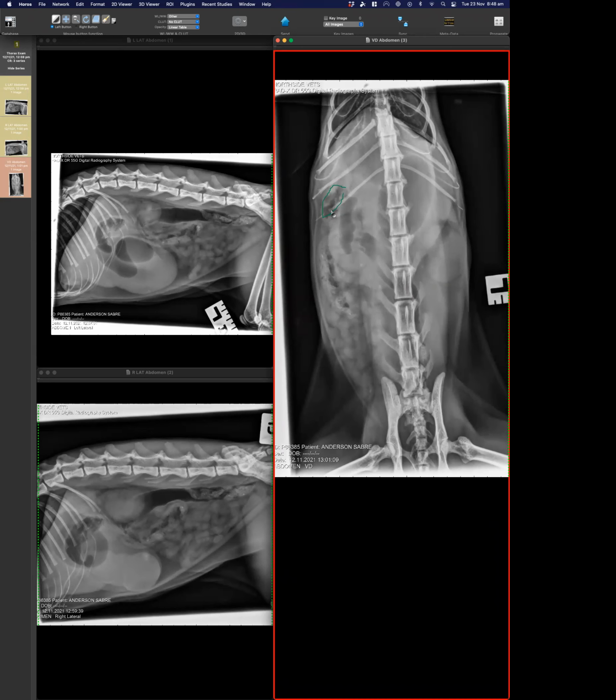And then you probably said that this is still stomach because, well, that's not the edge of the stomach. In fact, the edge of the stomach is probably there. Yeah, I think it comes here, yes, and then even probably here. See this bumpy or undulating contour? I think it goes all the way down there. Yeah.